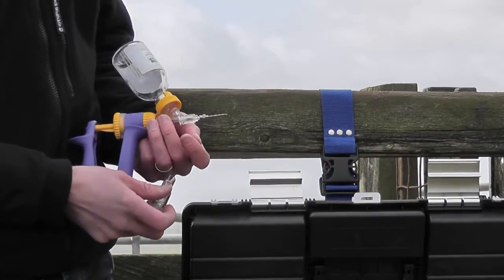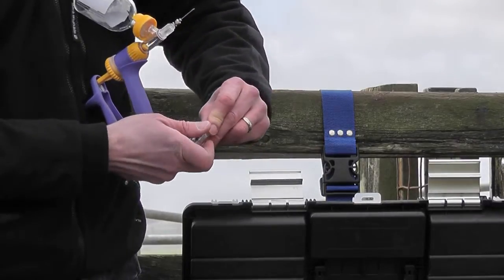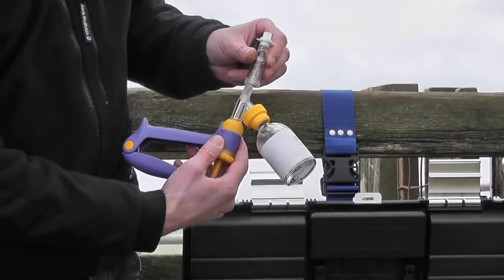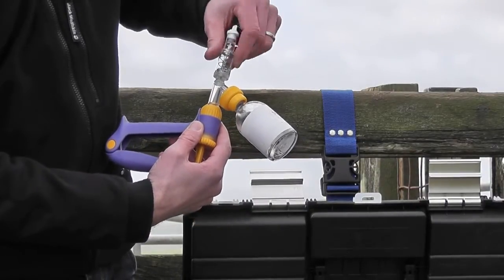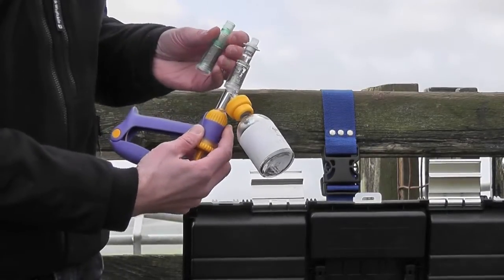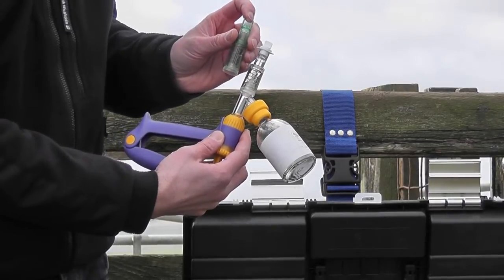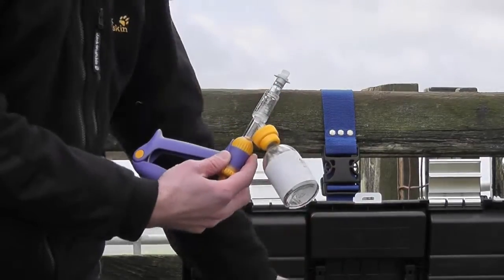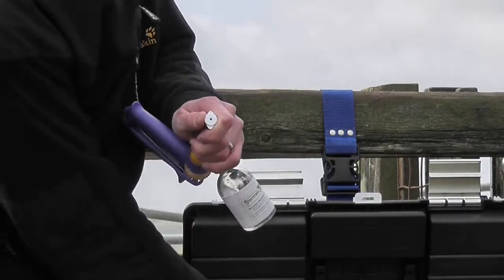To help with this, Steri-Matic has a needle guard and into the end of this we can fit a Steri-Cap which contains some disinfectant. So set the syringe up as normal, make sure you firmly attach the needle and then the needle guard is a screw fit around the outside. The clear needle guard is suitable for a sub-Q injection with a half inch 12mm exposed needle, and the longer green sleeve is suitable for an intramuscular one inch 22mm injection depth.